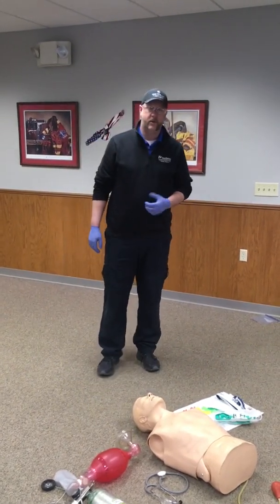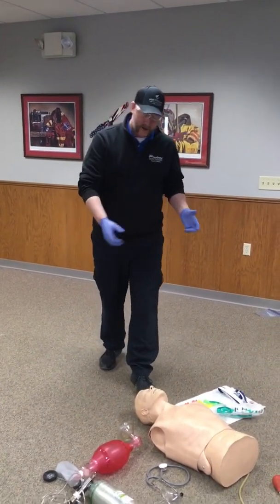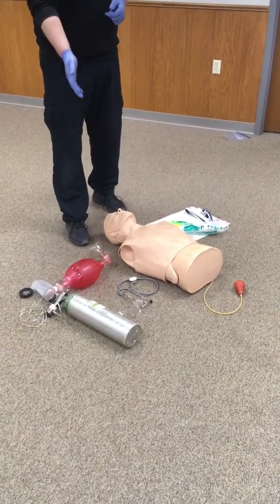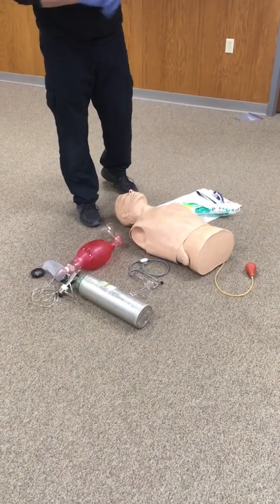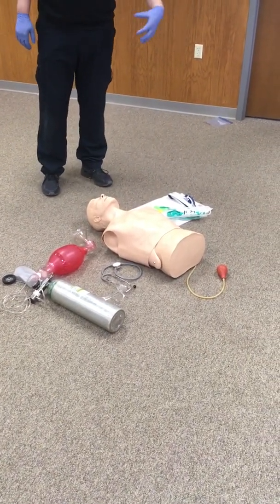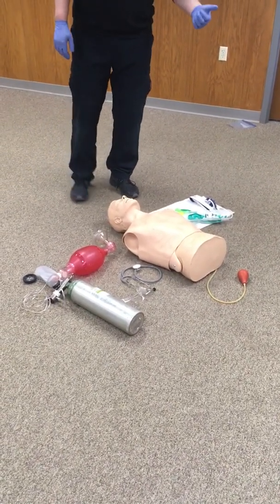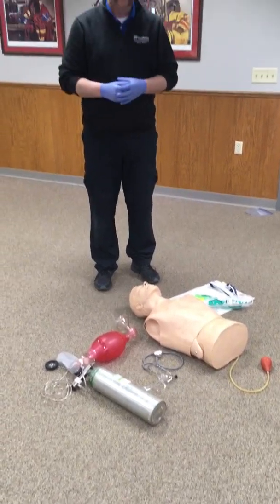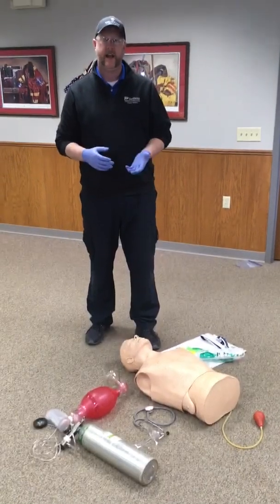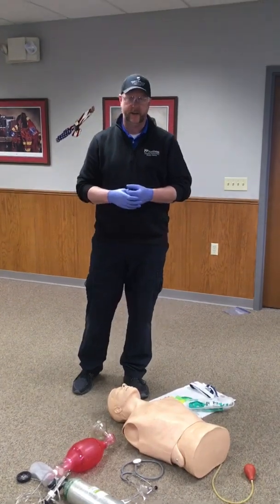This is the Advanced Airway Station, or the Supraglottic Airway Station, for the Advanced DMT psychomotor exam. About the equipment: there will be an airway mannequin on the floor, an oxygen tank and cylinder with tubing, a BVM and mask, a stethoscope, some oral airways, nasal airways, and the supraglottic airway of your choice. During the station there'll be an IGEL, a combi tube, and the King Airway. In this video, we're going to show you the IGEL.